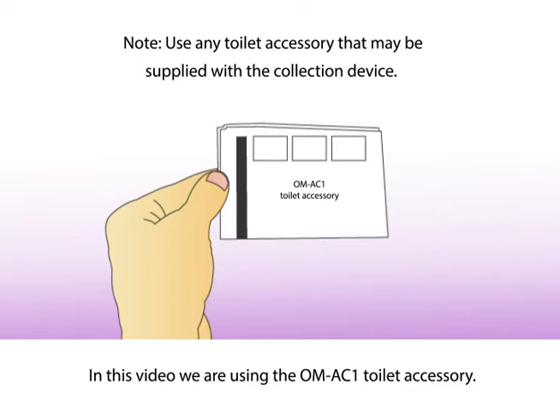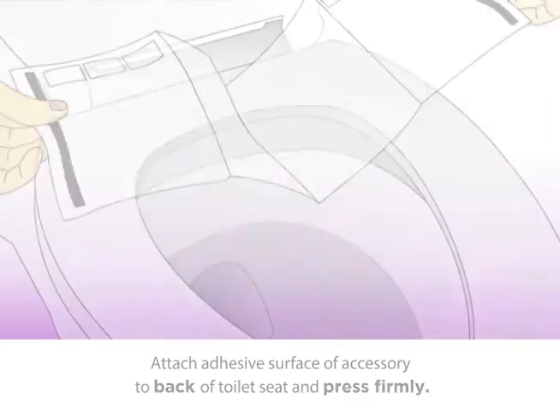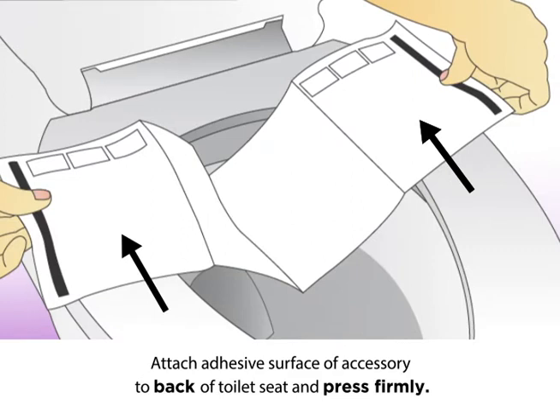In this video, we are using the OM-AC1 toilet accessory. Carefully open the toilet accessory, then attach the adhesive surface of the accessory to the back of the toilet seat and press firmly.